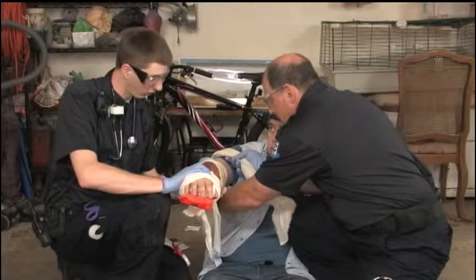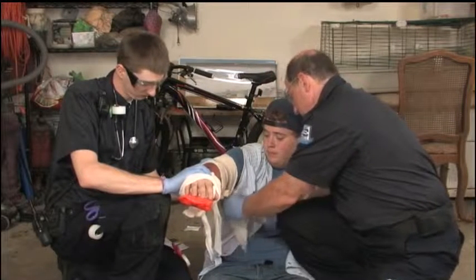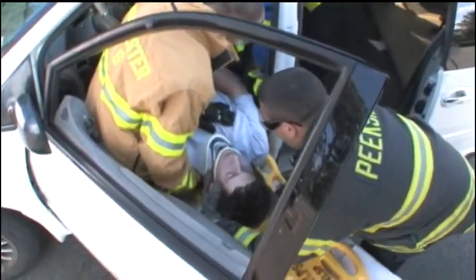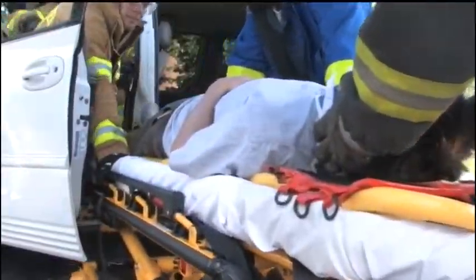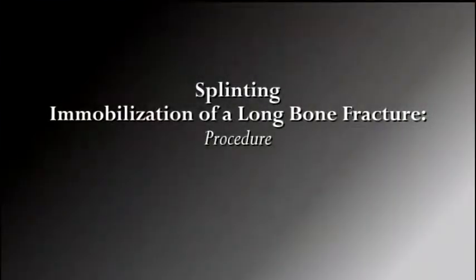Only stable patients with minor or isolated injuries should have individual extremities splinted on scene. Any unstable patient or a patient with life-threatening injuries should have his or her entire body immobilized on a long spine board and transported without delay.